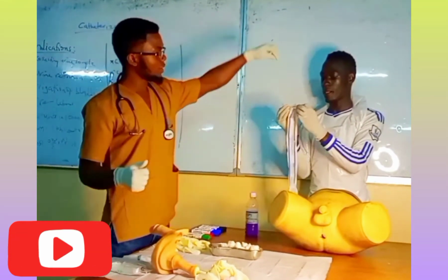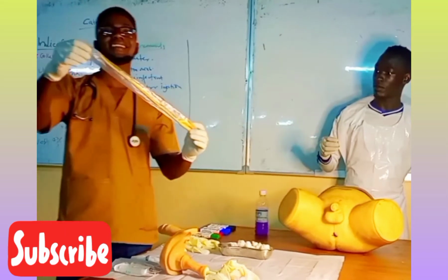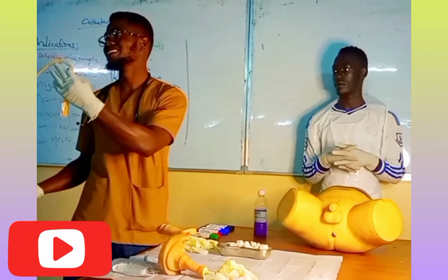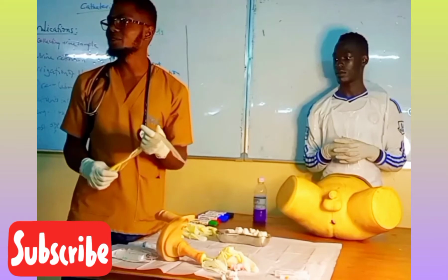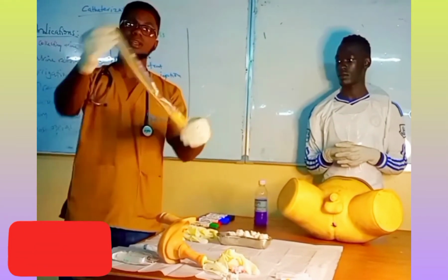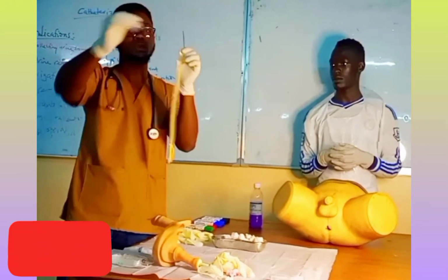So after my assistant opening, which is the sterile one. So this is the second seal, and this is the sterile seal. Since I'm also sterile with my sterile gloves, I'm going to hold the sterile seal. Are we together? The next thing, this seal has a weak point, a weak end. So you hold the weak end and you open it.